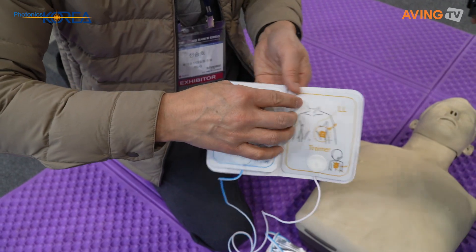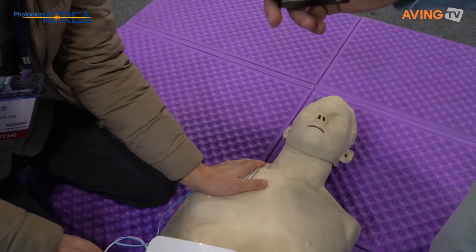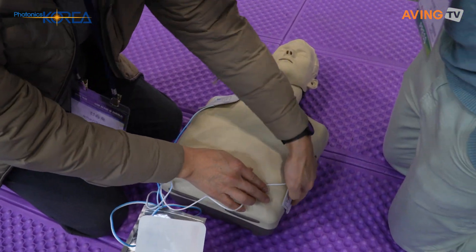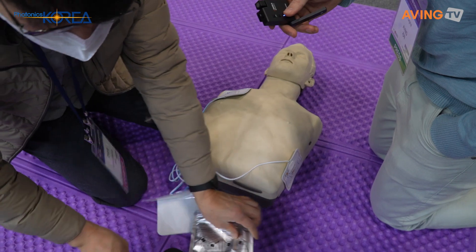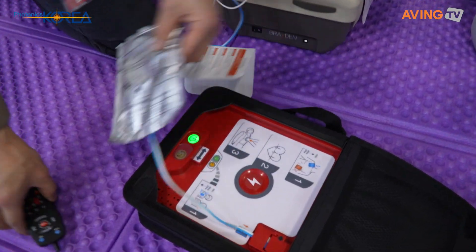The pads are labeled R-A and L-L. You take them and peel off the film. R-A goes on the right side, and L-L goes on the left side. Then push the button and power on.